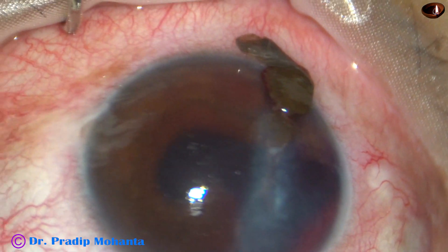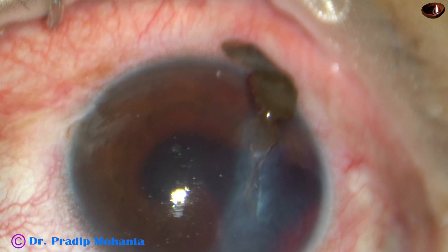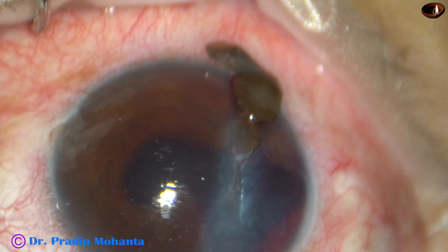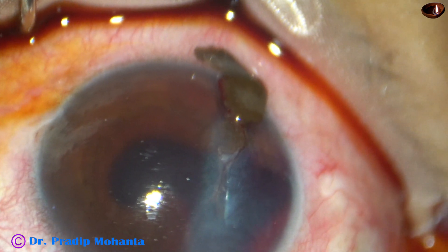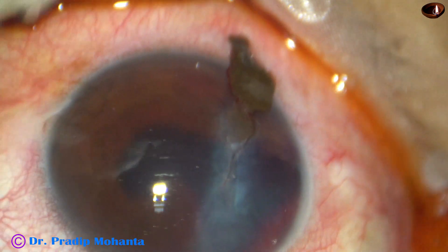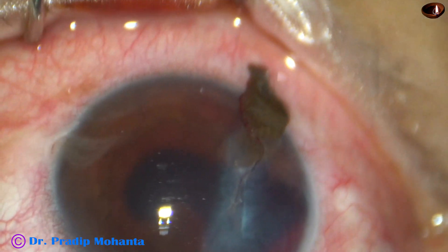Peribulbar anesthesia has been given very carefully. Just a little bit of lignocaine has been injected inferiorly and a little bit superiorly, without touching any muscles of the eye. And now I am applying povidone iodine around the cornea, which is not coming to the corneal wound.